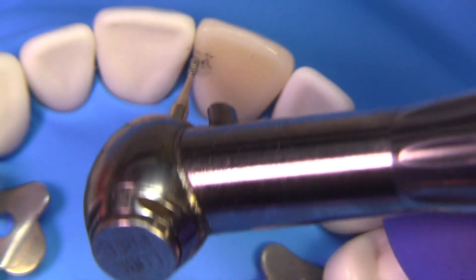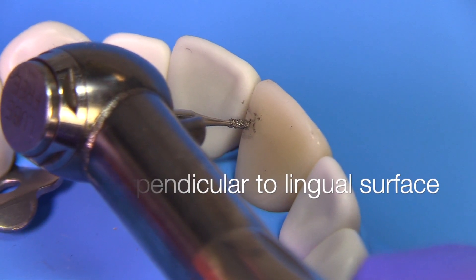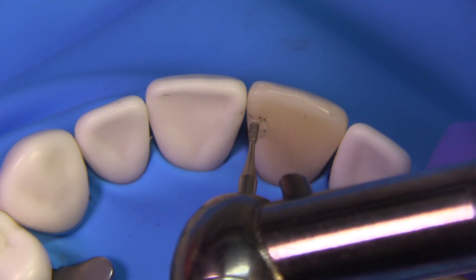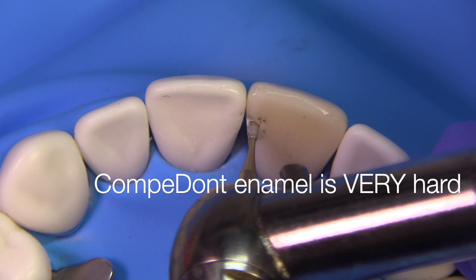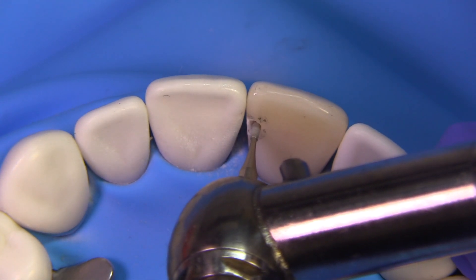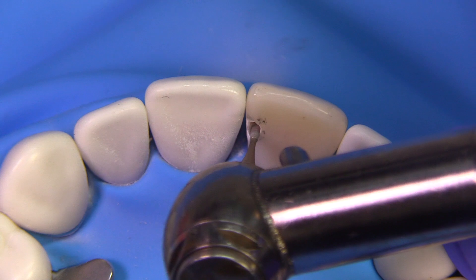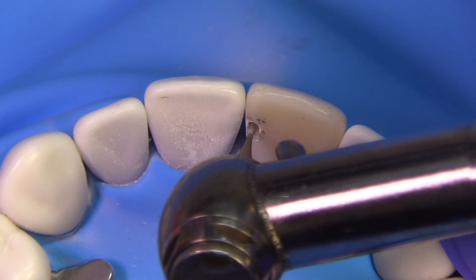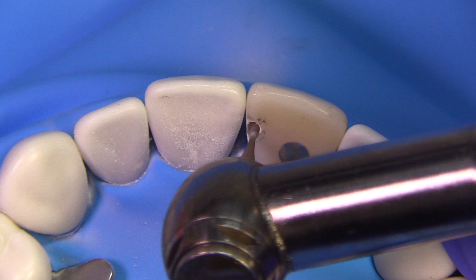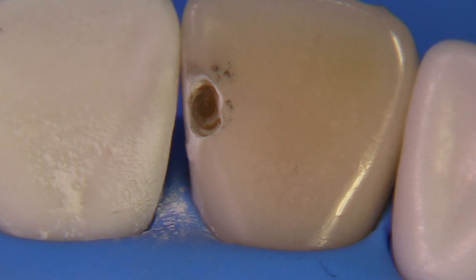On a class 3, make sure that you are angling the bur 90 degrees — perpendicular to the lingual surface — when you start the preparation. All of this will be done in the mirror, or you may be able to use a little direct vision. The enamel is very hard, so go slowly and get a small hole started so the bur is more cradled by the periphery of enamel, then work it in toward the facial, keeping the bur perpendicular the entire time. I like to push the bur in to its full length — I think that gives about the right amount of facial extension for the ideal preparation.